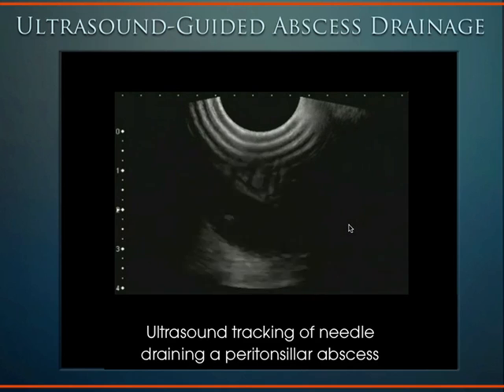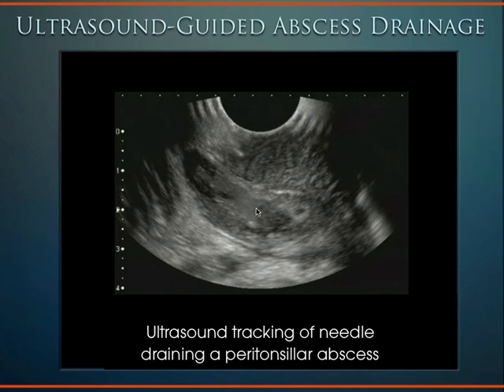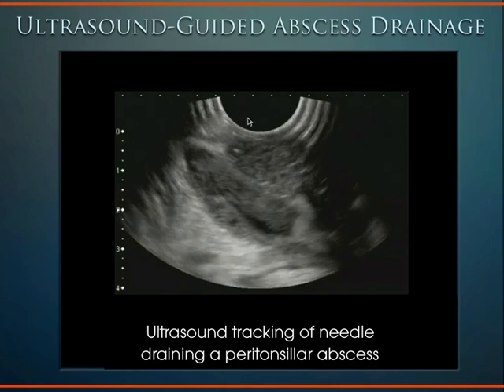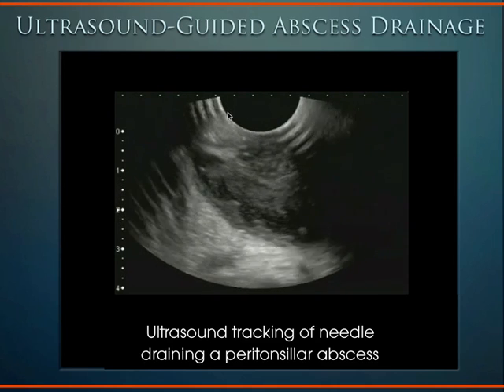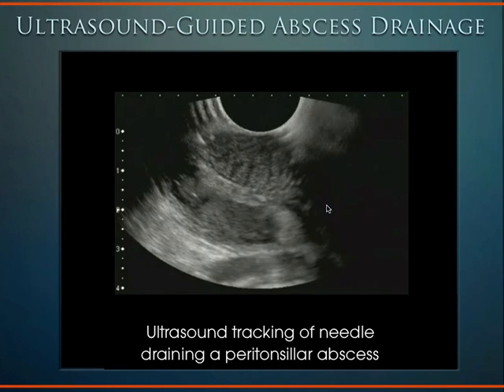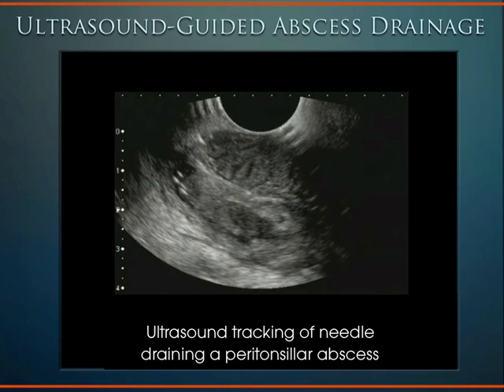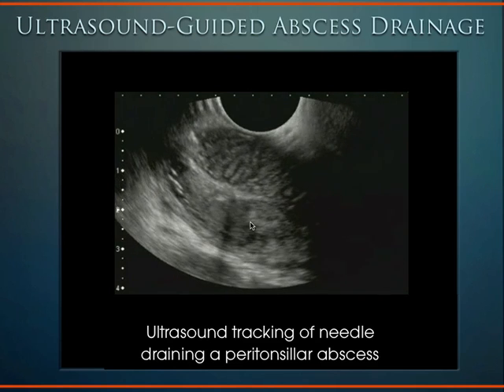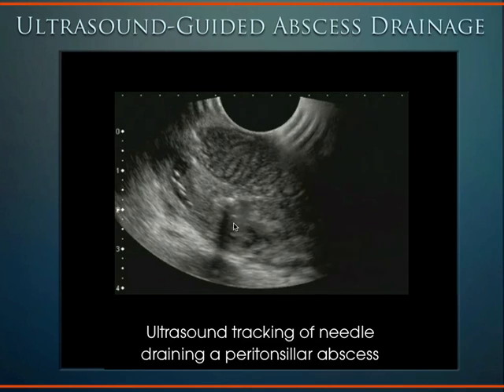You might want to refer some of these more complicated ones to a specialist like an otolaryngologist. But we went for this one ourselves. You're going to see here a needle coming into this abscess, and that's ultrasound guided. We can see the needle has made its way. Actually, you can see the distension of the tissue down here, that needle tracking into the abscess.